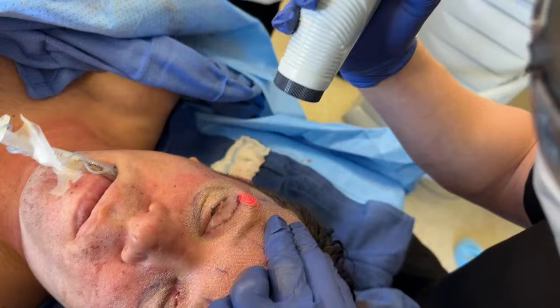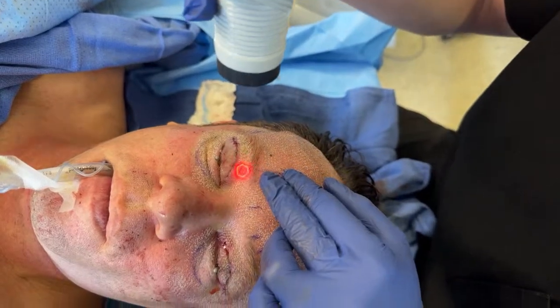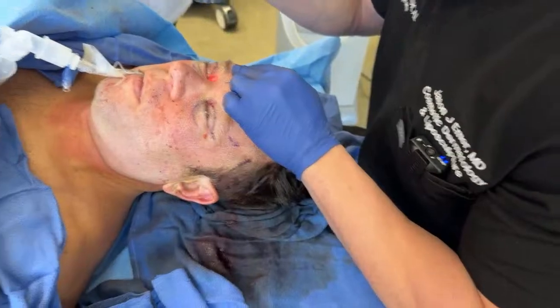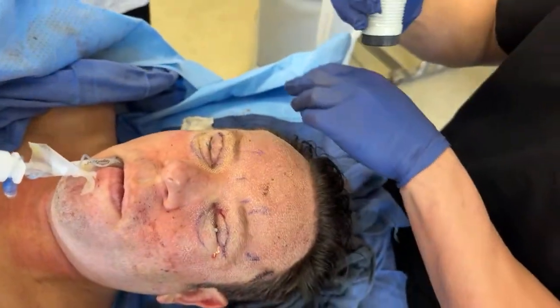This is one of the most aggressive lasers. We do have several aggressive lasers at our office. This is going to be one of them. We both have deep smile lines. We can either use some filler there. We can do several microneedling treatments, or you can do a deep plane facelift, which will pull those lines a lot tighter.